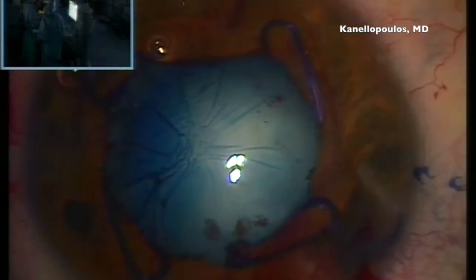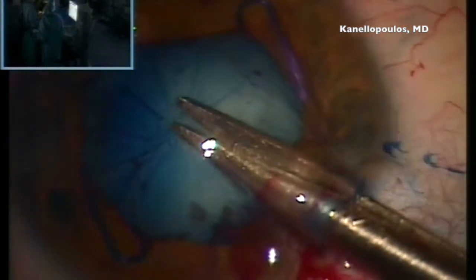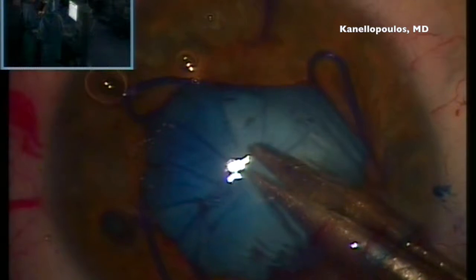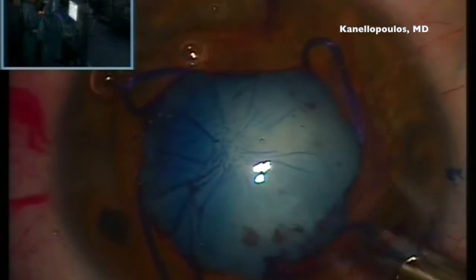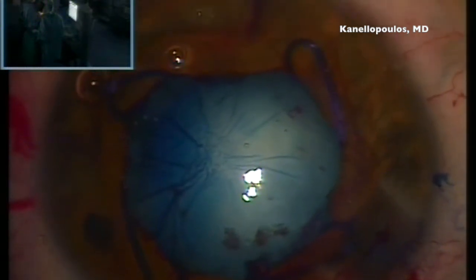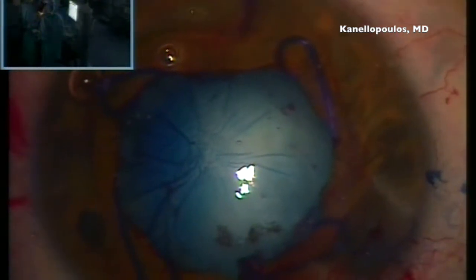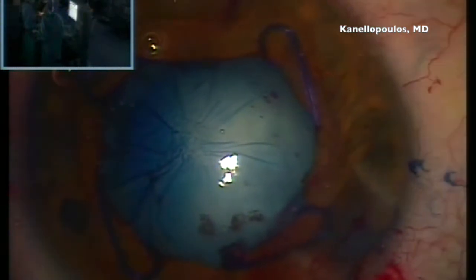I'm going to try and incise the anterior capsule with a cystotome without any success. And of course, all the times that incising the anterior capsule by mistake come to mind here. So I'm going to use the Vannas scissors to go in a more radical way to cut through the very tenacious anterior capsule. I need some resistance or something to fold the anterior capsule.